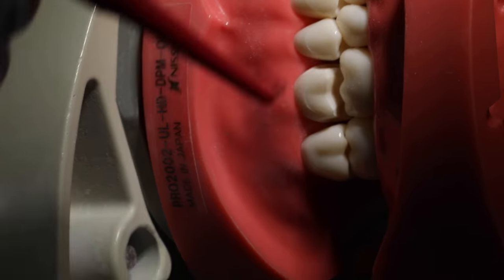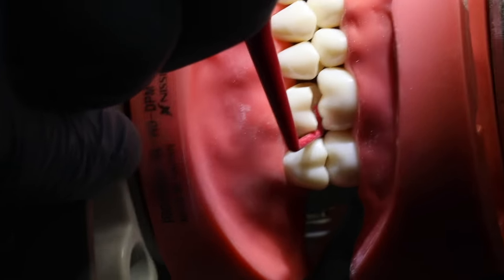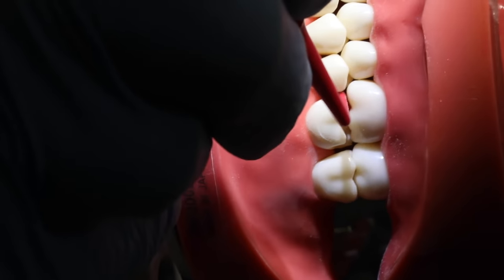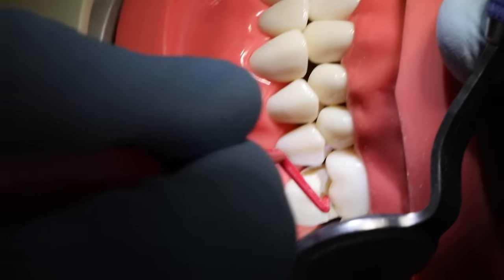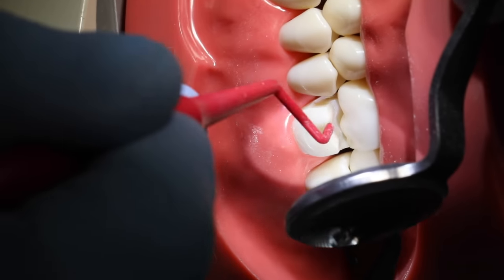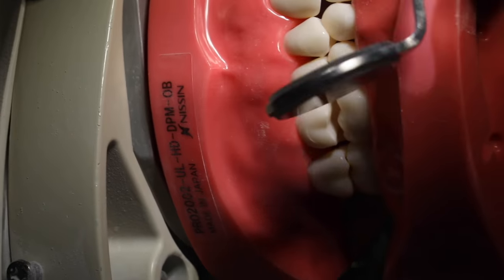There's a couple of places there that are close. Let's come in from the distal. That's fine, and that's fine. So where we're a little tight is still right there. Well, a little bit all the way along, primarily the non-functional cusp. So we'll take that down a little bit more to make sure we have that minimum of 1.5 millimeters of clearance.